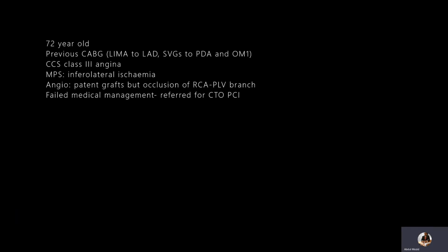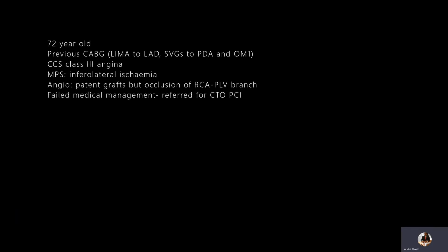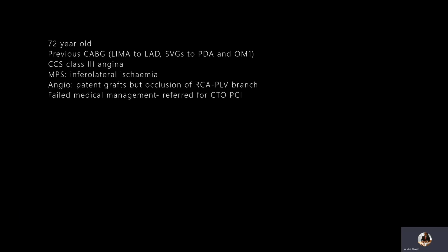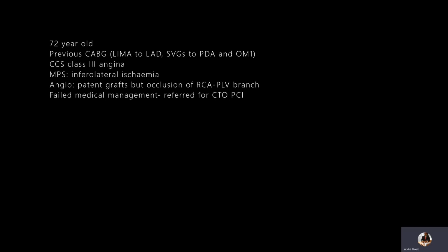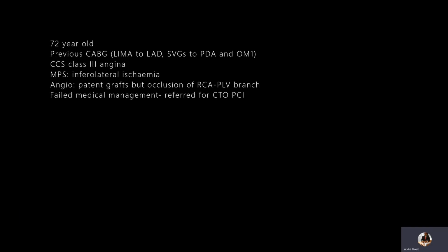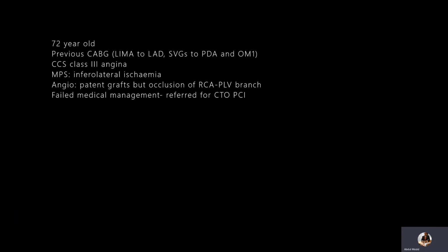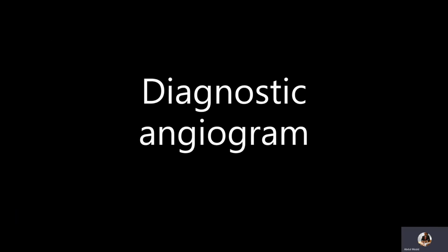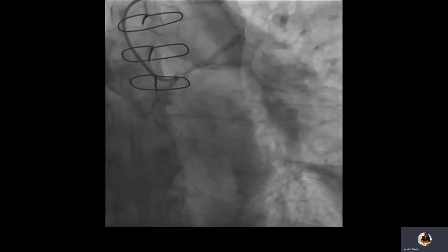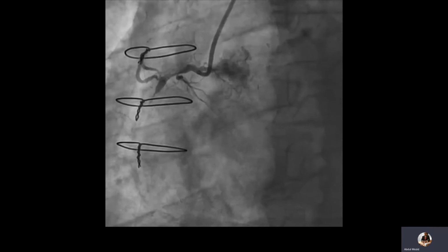So this was a 72-year-old man who had undergone previous coronary bypass surgery with LIMA to LAD and vein grafts to his PDA and obtuse marginal. He presented with CCS class 3 angina, and the perfusion imaging showed inferolateral ischemia. His coronary angiography showed patent grafts but an occlusion of the RCA-PLV branch, and he had persistent symptoms despite medical therapy. This was his previous coronary angiogram showing occluded left main.